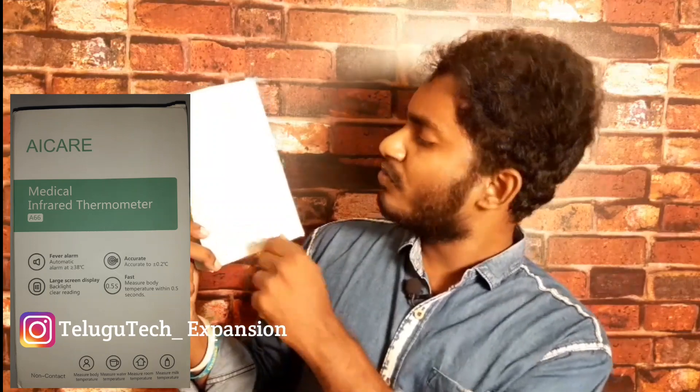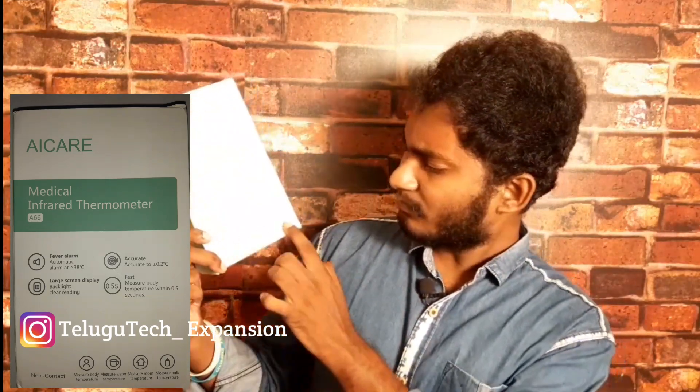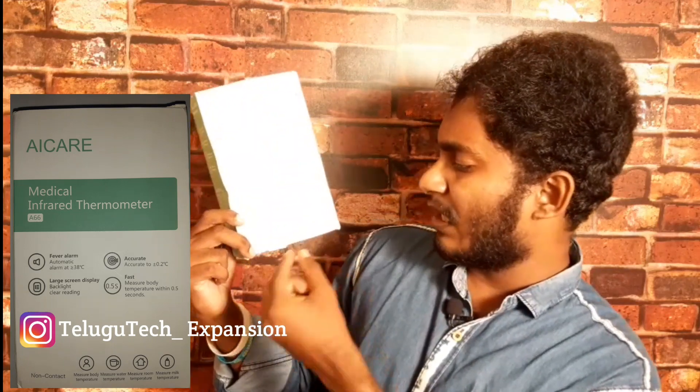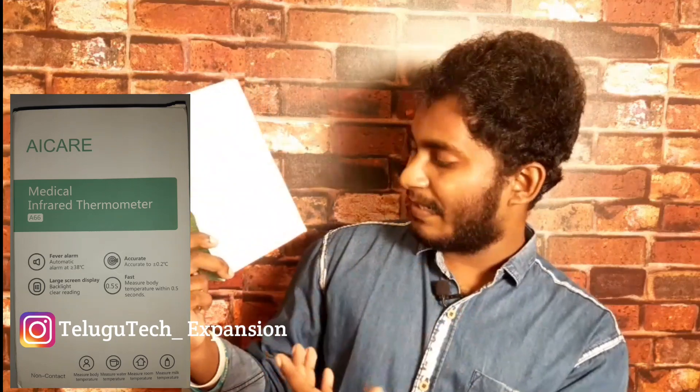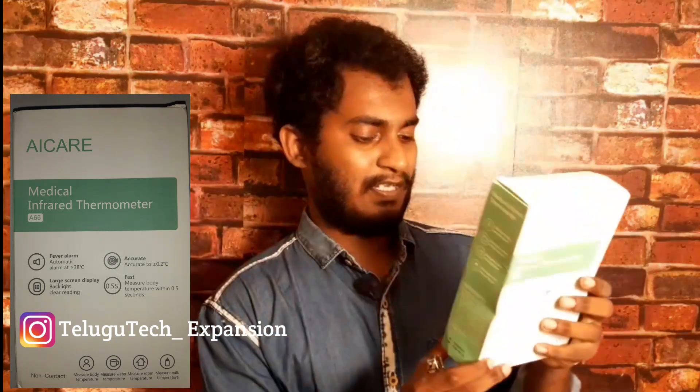It is a brand new Fever Alarm System. The screen will be updated with an accuracy of 0.1°C temperature. We can measure body temperature quickly. There will be some precautions. We can measure body temperature, water temperature, room temperature, and milk temperature. We will then go through the front and back of the product.